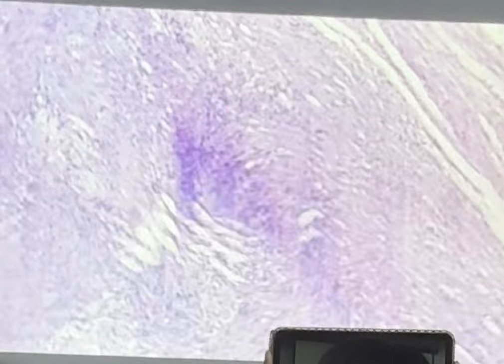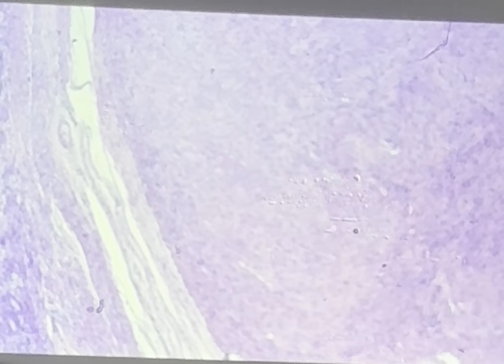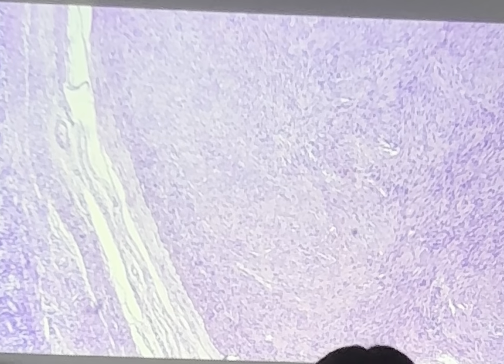They resemble the same cells that you see in the myometrium here. So these are smooth muscle cells. So a myoma is a benign tumor of smooth muscle. It has what we call the classic whorled appearance, but the whorled appearance is best seen grossly. You can vaguely see it going around, like swirling here, forming like a little cyclone. That's the whorled appearance, better seen grossly. You can see it there.